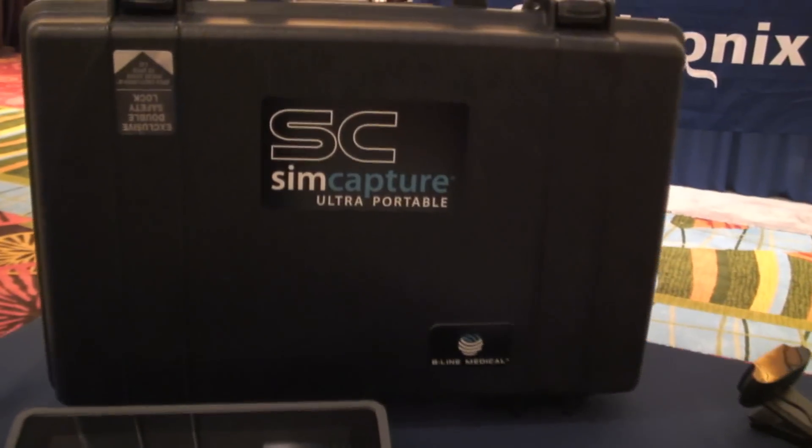Hi, this is Lance with HealthySimulation.com. I'm at IMSH 2013, in the exhibit hall checking out the Beeline booth. I'm here with Sandy, who's our best Twitter friend ever in the entire universe. We're checking out a new product from Beeline Medical, the Ultra Portable Unit. Sandy, you want to tell us a little bit about what we're seeing here?